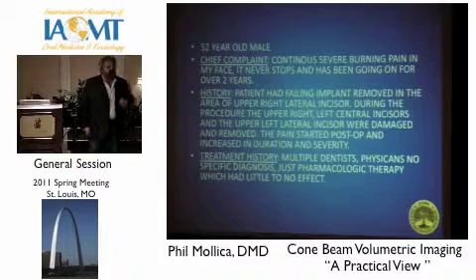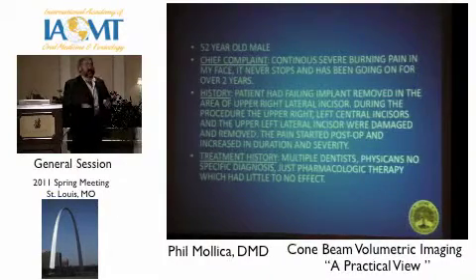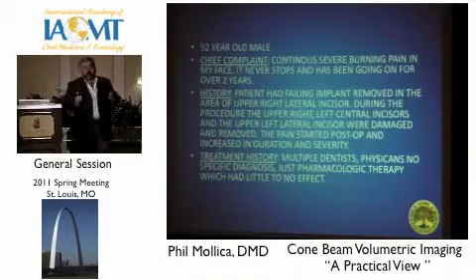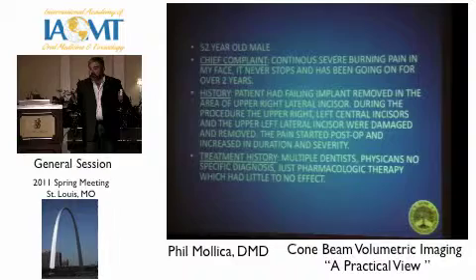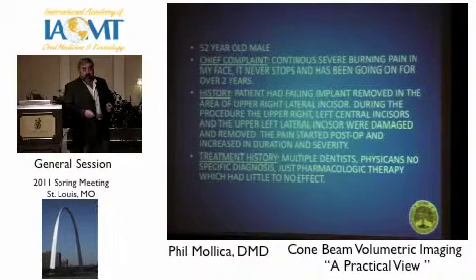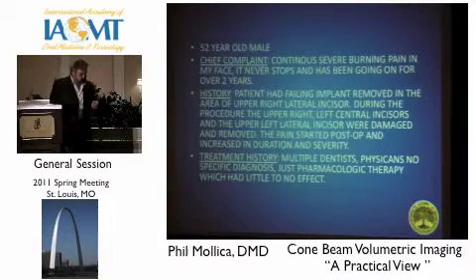Something I'm missing here. He says, okay, cone beam time, because he has some x-rays. I don't know if I want the x-rays. I said, listen, with the cone beam, you're going to give the patient exposure about like a traditional full mouth series. That's it. But you need the information. So we take a cone beam on this gentleman.